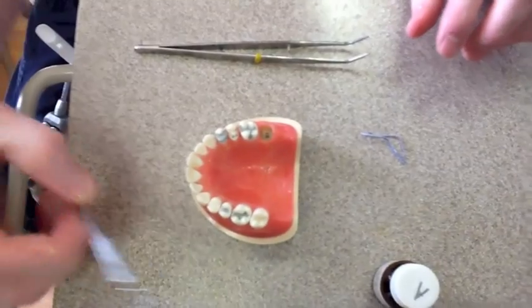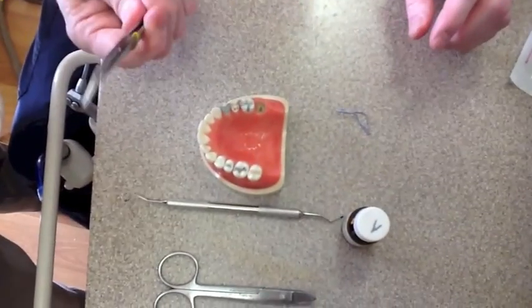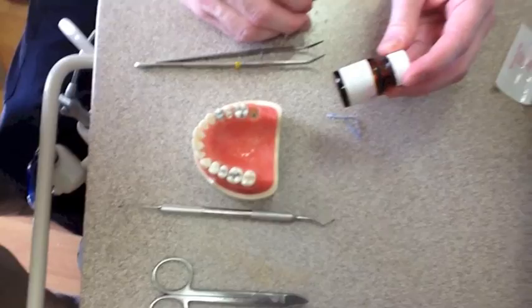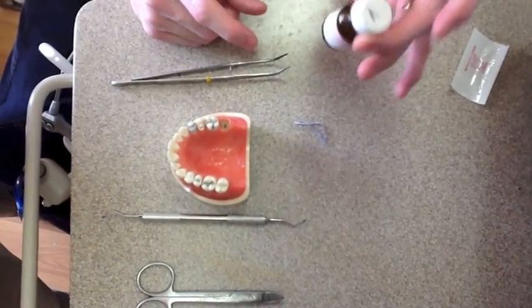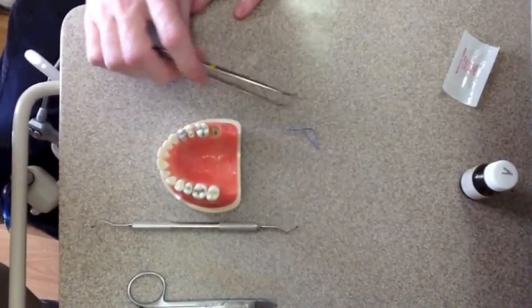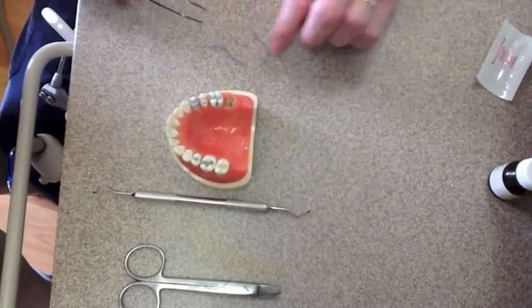We got a cord packer. We got the scissors, our cotton pliers, and this is our Hemodent. This is where you keep the cords. Now I don't want you to use the soaked ones, but I got it out so you can see that when we're with the patient, that's where they are. I've already cut my own cord to do it, and we're going to do a posterior one today.